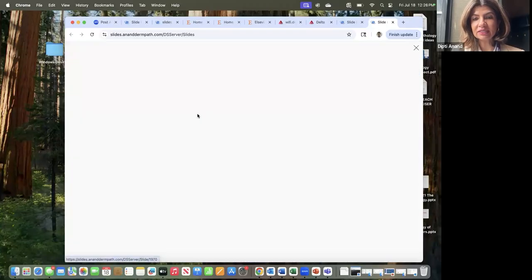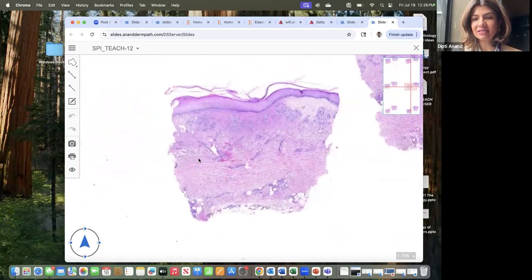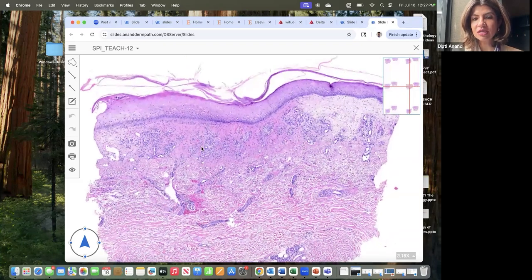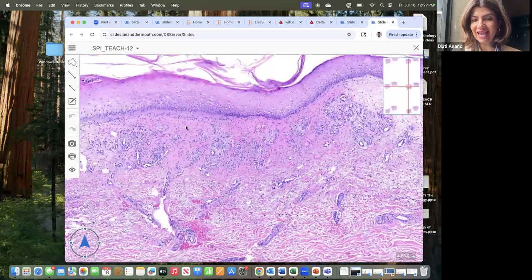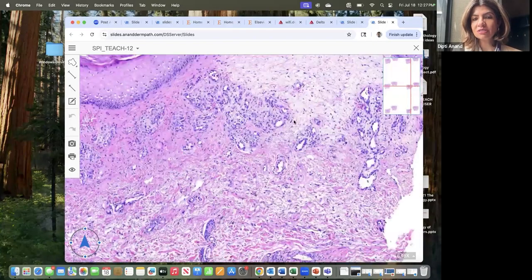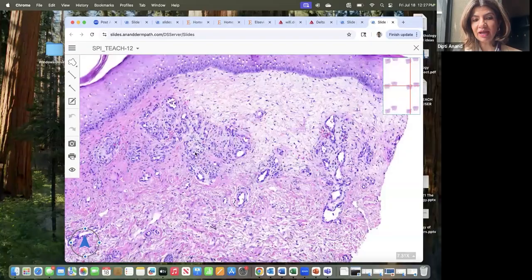The next one in the eczematous derm, which is asked, is stasis derm. Stasis dermatitis is characterized as a chronic eczematous dermatitis. So you can see a thick epidermis on top with not a lot of active spongiosis. But what you see in the dermis are these cannonballs. So you can see the lobulated proliferation of these small sized thick walled vessels in the dermis with variable degree of dermal edema and fibrosis.